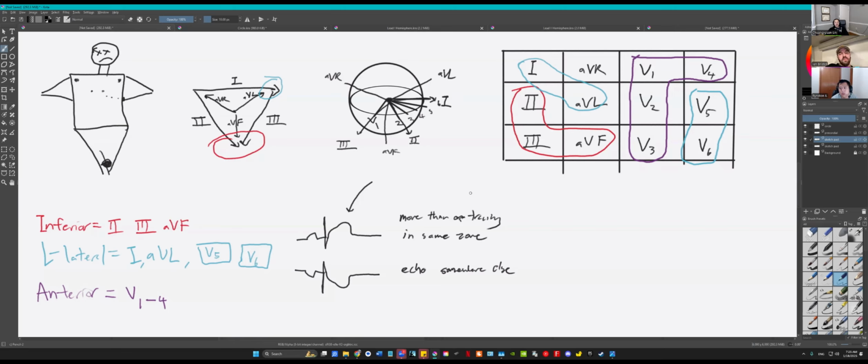He had a left anterior descending artery blockage, the LAD, that feeds the left side and the septum of the heart. This is a big blood vessel. It was blocked where it left the aorta. If you can imagine, that whole blood vessel is screwed up. It was high enough, at the very top of the heart, where it was blocked at first, that we saw the aVR STEMI. And the whole rest of the heart was the echo of that blockage.